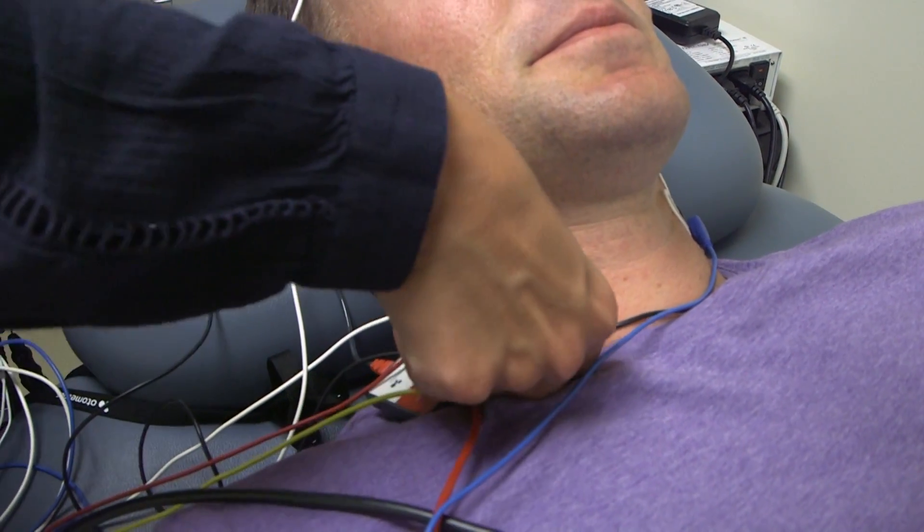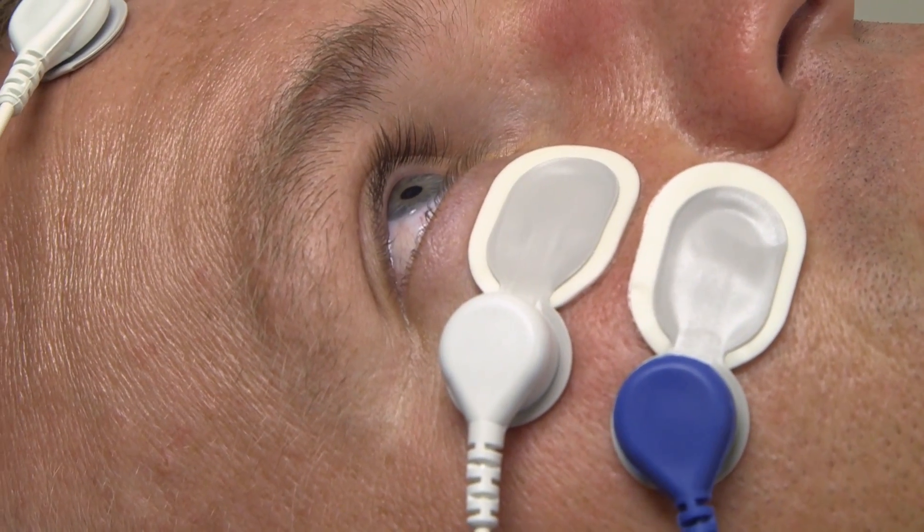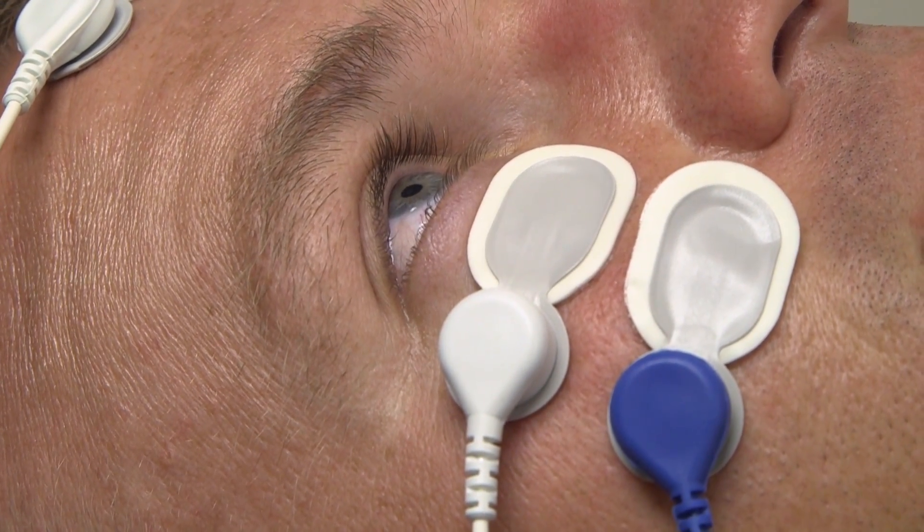There are typically two VEMP responses. We have the cervical VEMP, which is measured at the neck, and then we have the ocular VEMP, which is measured underneath the eyes.